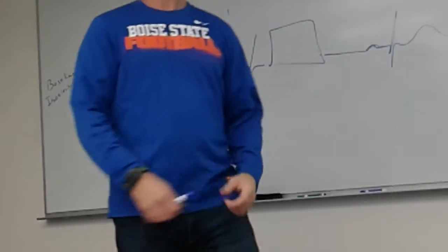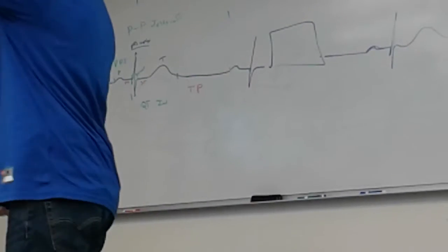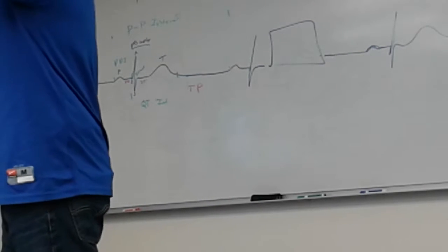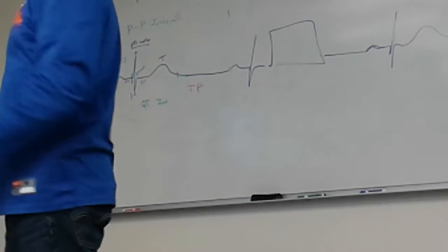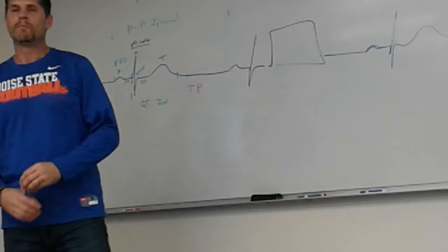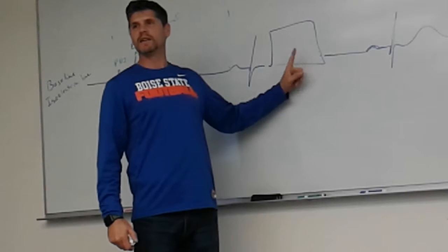Anomaly. Just different. Outlier. Artifact. Something's weird. Artifact: something else not related to their physiology is affecting the EKG at that moment in time. Speed bump. Talking, breathing, who knows? Could be, because there is nothing that would contribute to that T wave looking different.